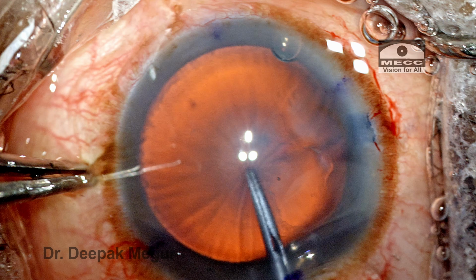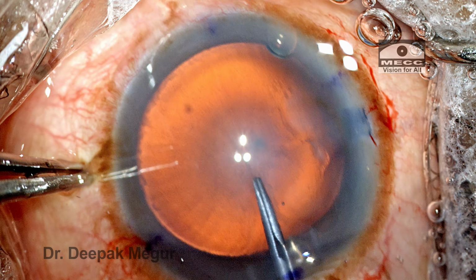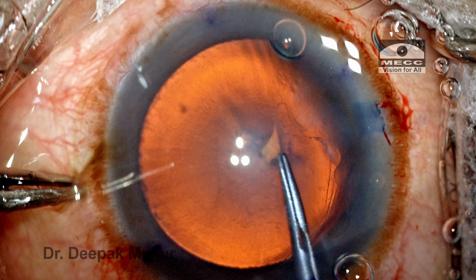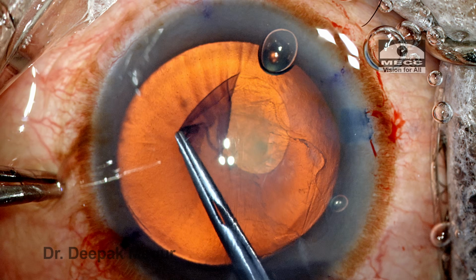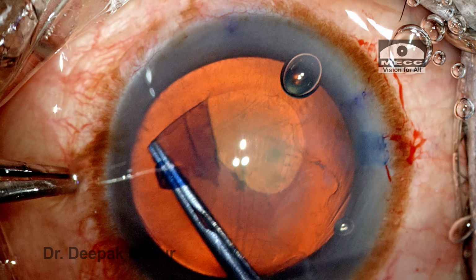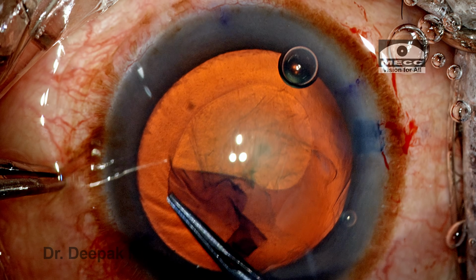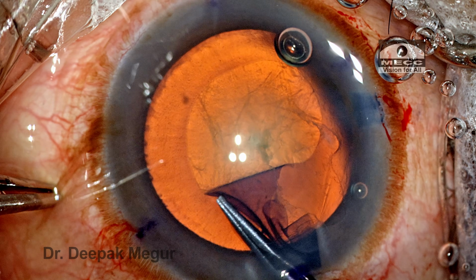So as soon as I touched the capsule, I could see the wrinkling of the anterior capsule, and the wrinkling is quite extensive, and this is confirmatory that the zonular weakness is quite significant. As I'm tearing the capsule, I can see that there are folds appearing near the tearing edge of the rhexis margin. Creating the rhexis was not very difficult, but one critical factor which I was focused on was to ensure that the rhexis is not more than 4.5 to 5 mm, because at this stage my options of fixing the lens are very limited.